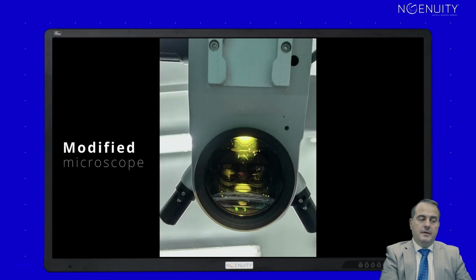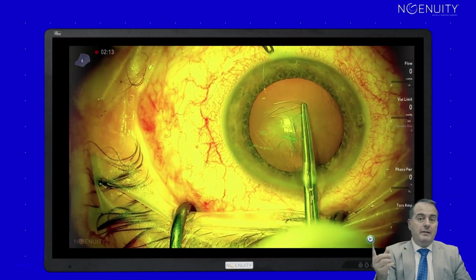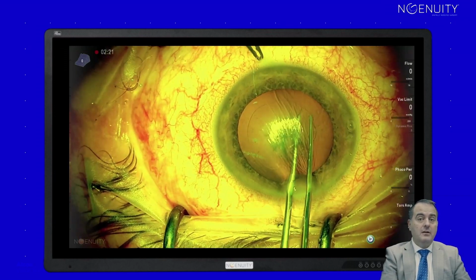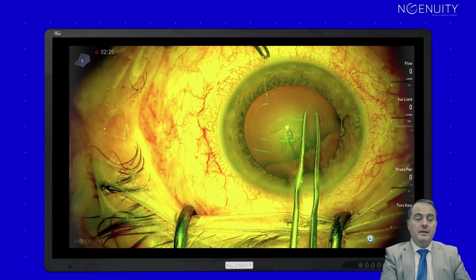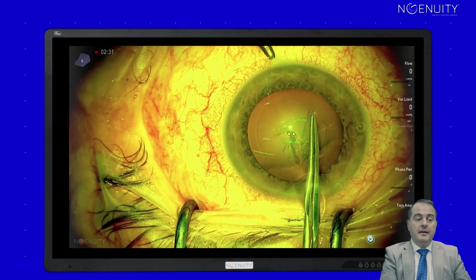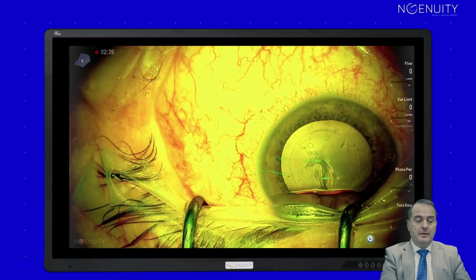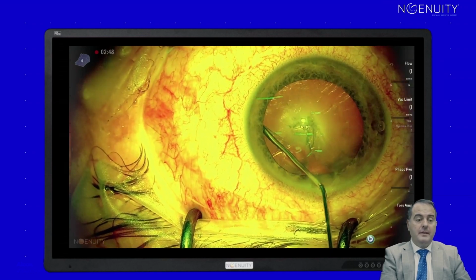This is something new. Modified light from the microscope. Up to now we were using only white light. Now we can modify the light and then apply a digital filter in order to increase the color separation, because actually we are aiming for the reflectance. So the reflected tissues, you can appreciate here how the capsule is shining and the wrinkles over the cornea. The image is getting sharper. I don't want to say that this is better, just to show that there are a lot of options.